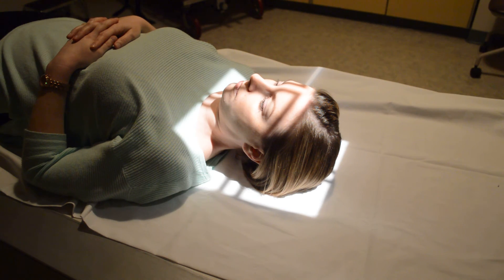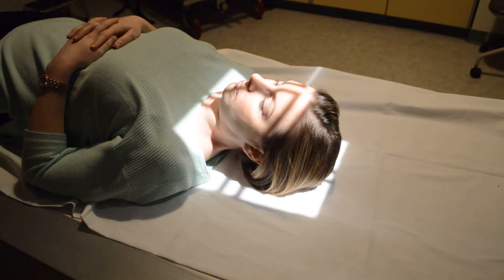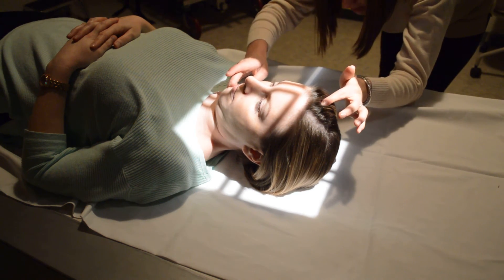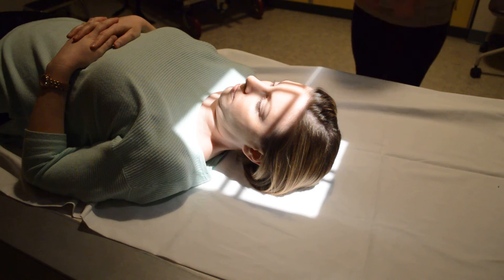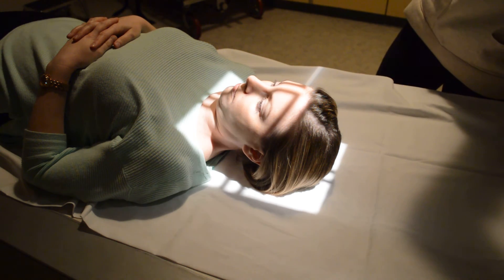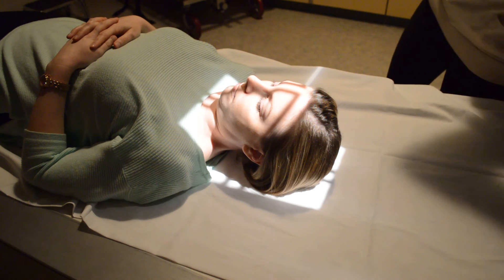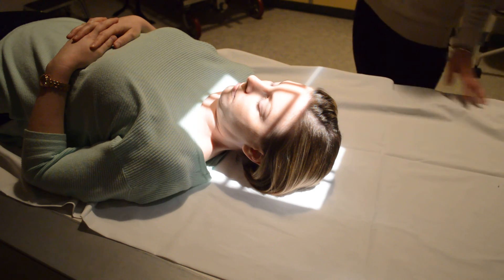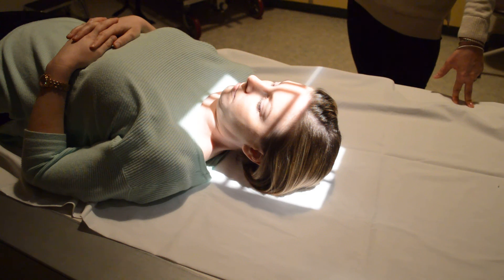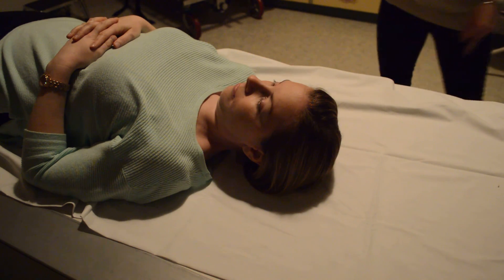I'm going to come to the head of the table. Make sure my patient isn't tilted or rotated, and make sure the OML is still perpendicular — I'm going to have Libby tuck a little bit more. You are able to collimate to the outer margins of the skull. Asking your patient to hold still is sufficient for this, so I'll say hold still and click.